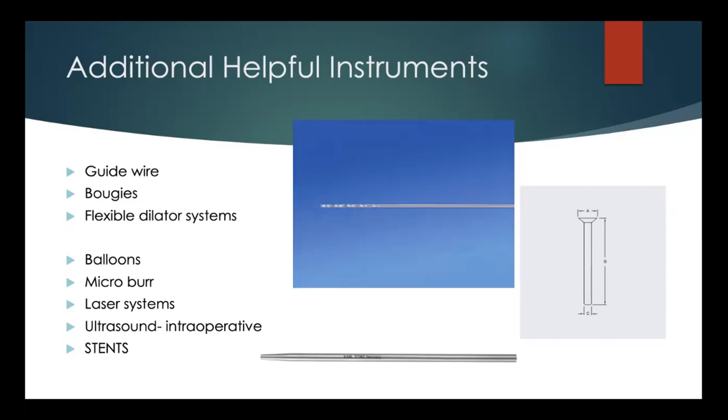Now, suppose there's a complete stenosis or a really, really narrow stenosis, let's say 90% stenosis of the duct. Sometimes with your ultrasound done side by side, you can advance your scope, not seeing the lumen of the scope, and just tracking it with the ultrasound. And this is something really magical that I saw in Langen. I've not had the guts to do it so far myself, but it's really, really fascinating the way they were able to achieve dilation of almost a complete stenosis of the duct. And of course, at the end of the procedure, stents are invaluable when we're dealing with strictures.